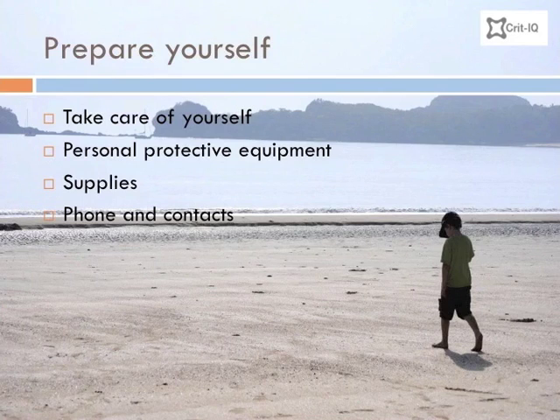Consider the possibility that you could be dealing with this patient for some time. Ensure that you have eaten and taken the opportunity to go to the toilet. Make sure your personal protective equipment is available. Consider if you need other resources such as clothing, food, water, and money if you are transporting a patient to another institution. Ensure that your mobile phone is charged and that you have the contact numbers you need in case of emergency.